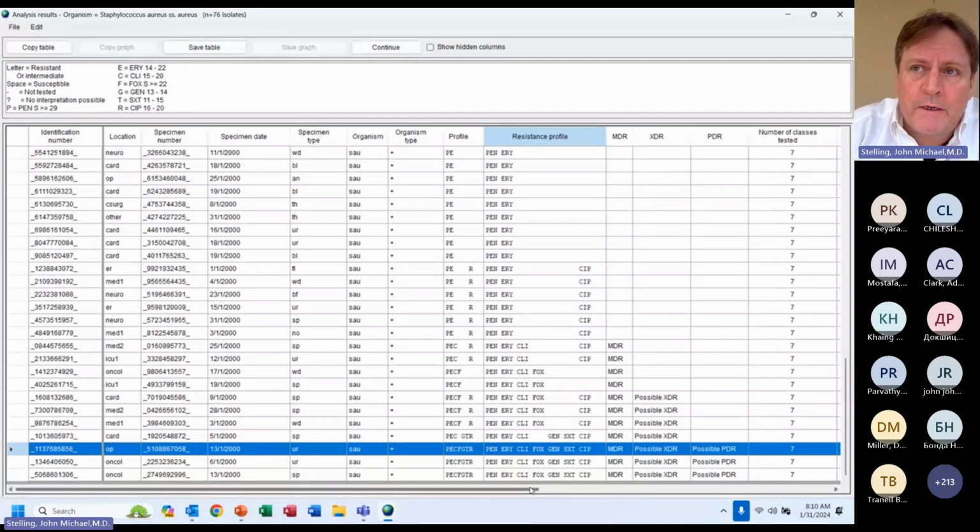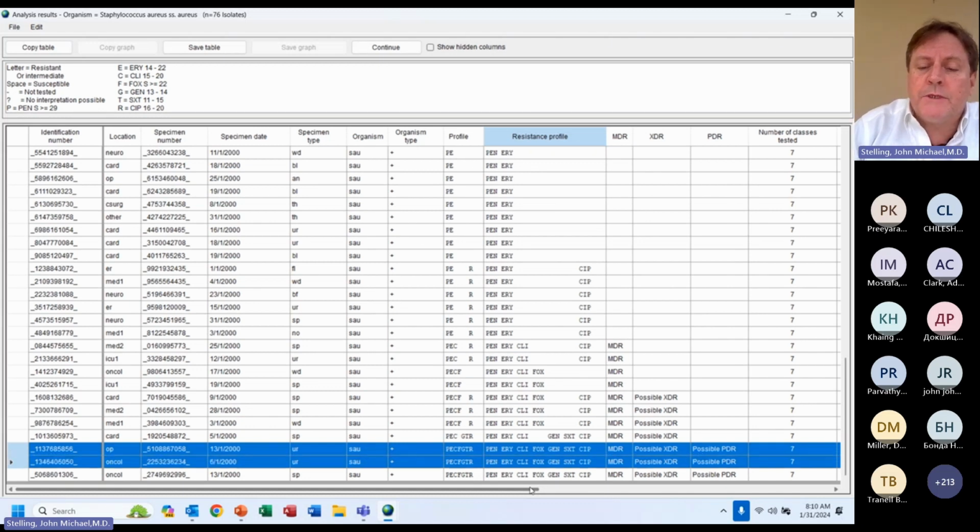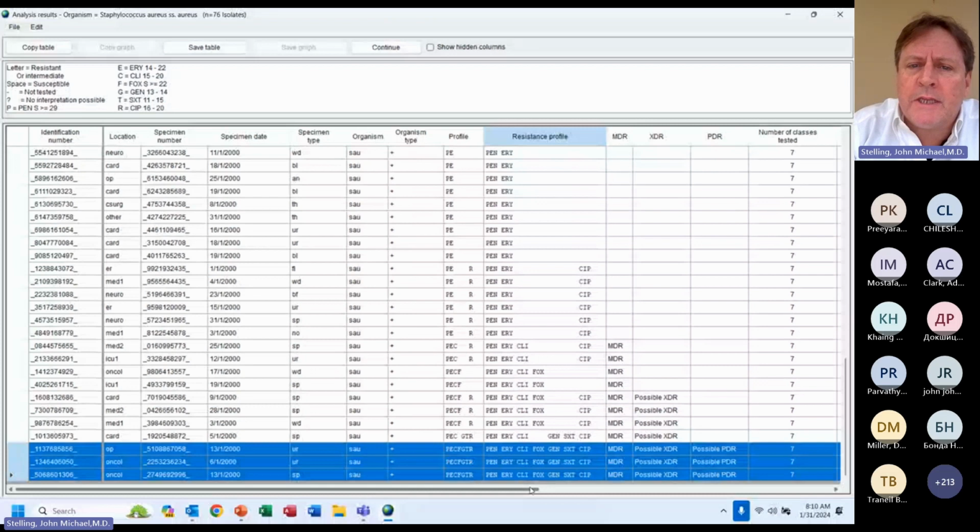These might be former oncology patients, or they might be current oncology patients who went home, or they might be a family member, or they may have some other risk factor. So the multi-drug resistance pattern tells me more about the epidemiology of this particular strain. Not from a genotypic perspective, we don't have that information, but from a phenotypic perspective.